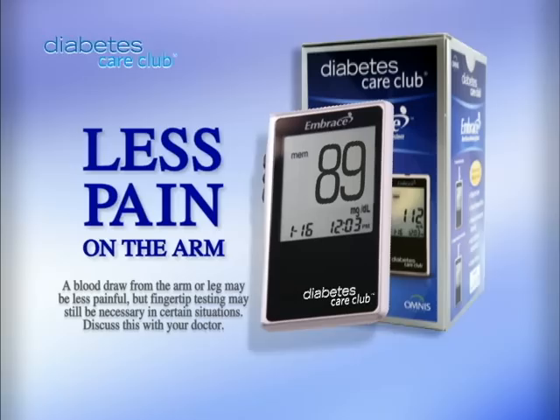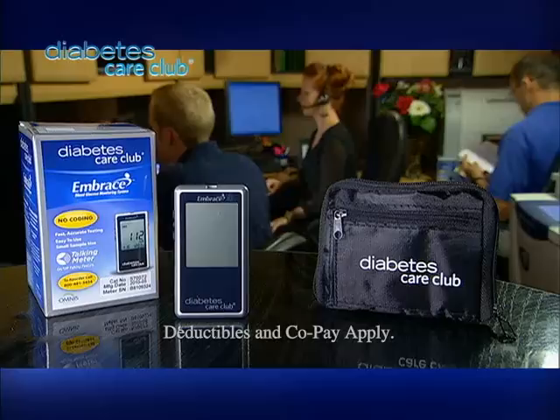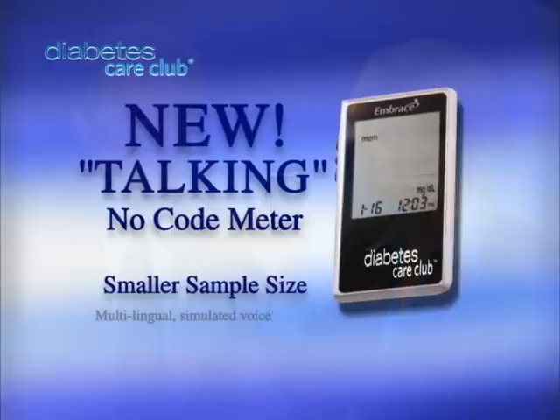You don't need to stab your fingertips anymore. The Embrace Meter from Diabetes Care Club is easier to use and nearly painless. And the best news is that Diabetes Care Club would love to send you one of these meters. This method hurts less, and because you can see and hear your results, it may be easier to understand.